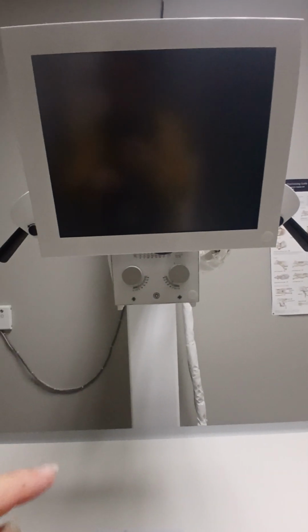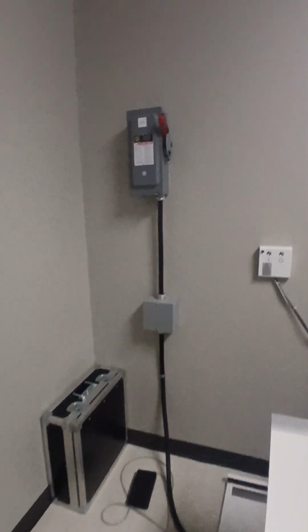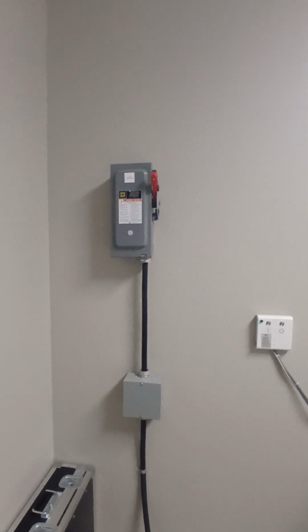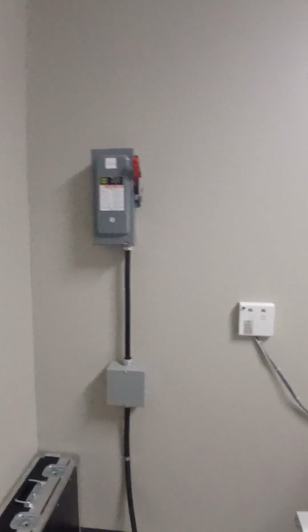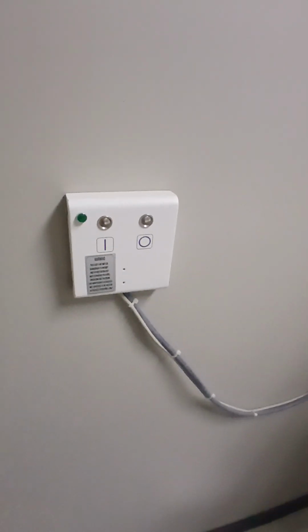But it's up here at this control panel that once we measure the patient, we can plug in the numbers to adjust our settings like KVP and MAS. So over here you see the big transformer or big electrical box. It is on right now. And then we will also turn the machine on here at the back of the wall.